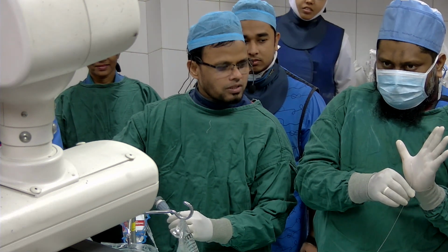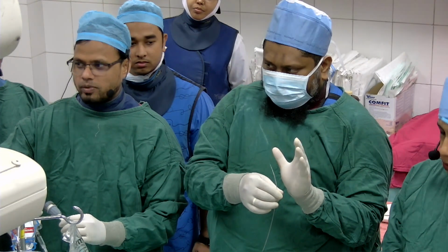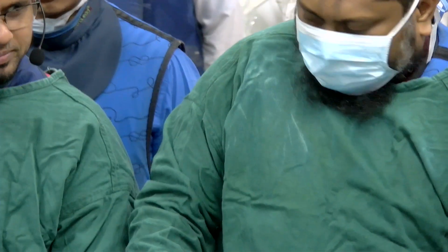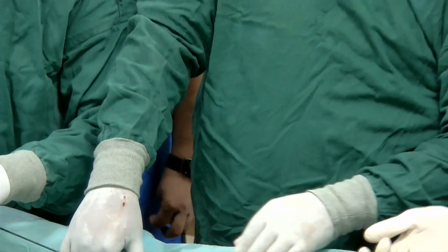So the main focus is only on keeping it air-free. The catheter should be air-free. And one of the most effective ways of making our catheter free from any air is by pushing this dye.